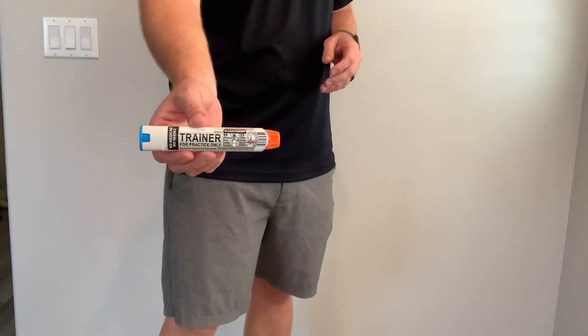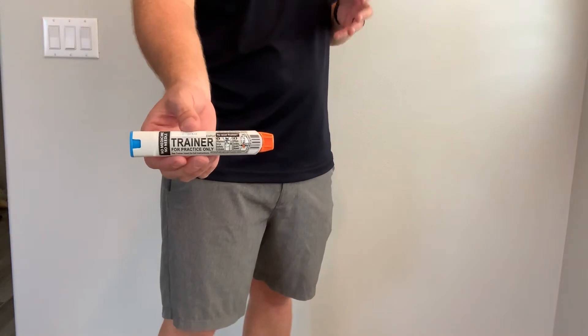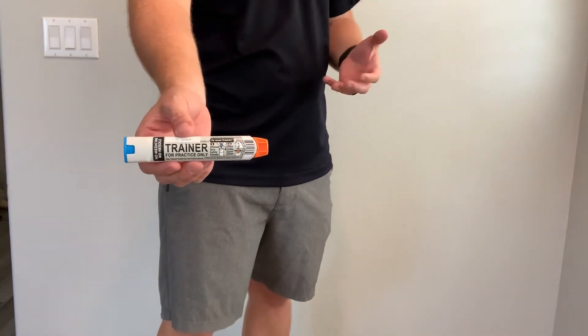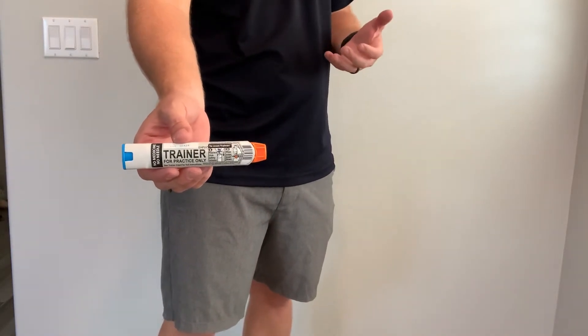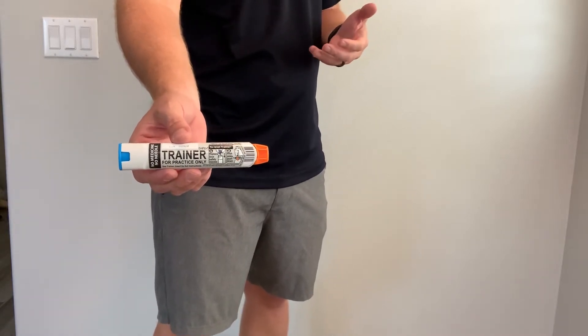Today we're going to talk about EpiPen and how to administer one. An EpiPen is a prescription medication that someone might carry with them if they're very allergic to something. The top three allergies are bees, peanuts, and shellfish.